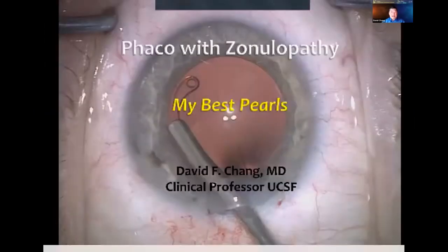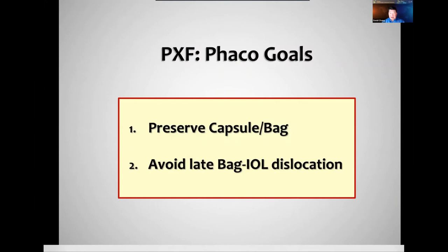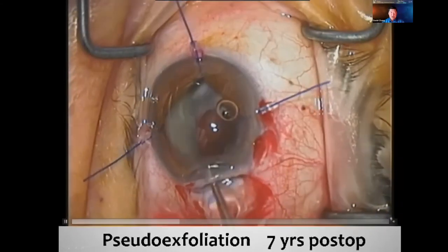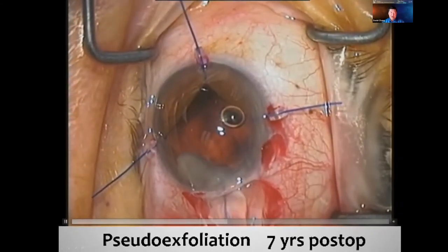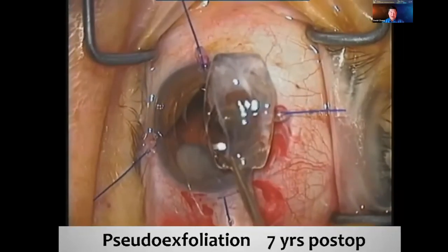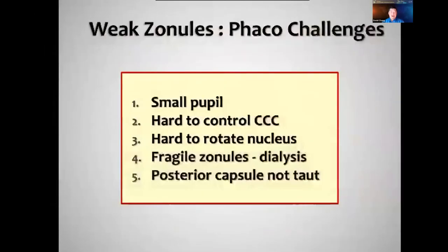I'm going to speak next and we'll now talk about the phaco itself — some of my best pearls, no financial interest in any device. With pseudo-exfoliation, we have two goals: we have to preserve the bag during surgery, but we also have to think about how we're going to avoid late bag-IOL dislocation. This is the situation you want to avoid — where seven years later the entire lens has dislocated and we have no suturing options.